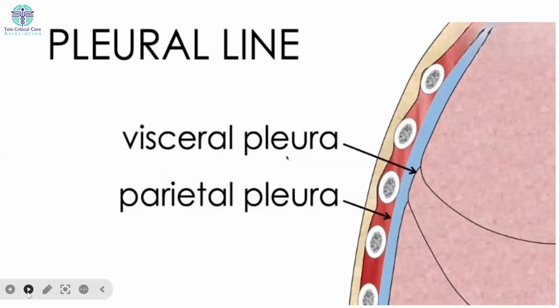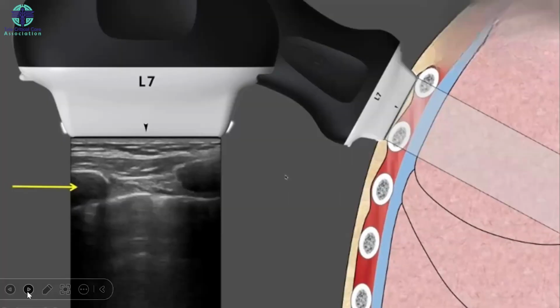You have to make sure that you see the pleura when you do the lung ultrasound. So this is the image we acquire while doing lung ultrasound. These are two ribs. Okay, this is skin, subcutaneous tissue, and this bright silver line is our pleural line, which is the area of interest. I will tell you how.